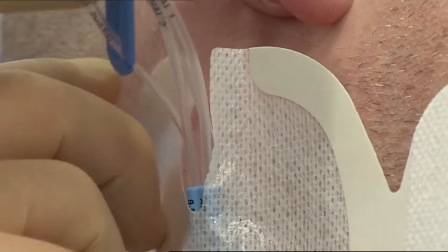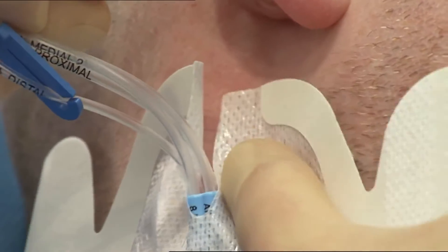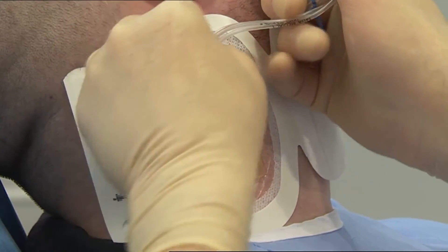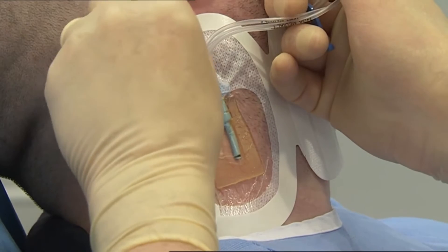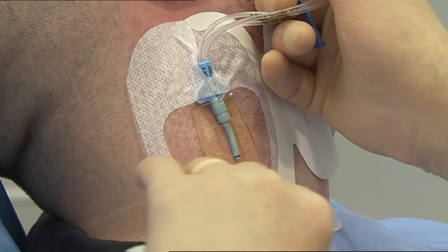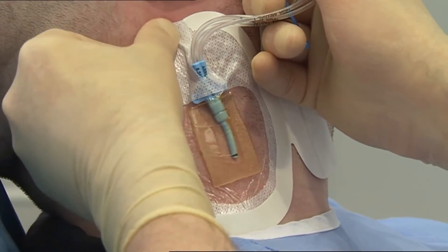Cross over the soft cloth section under the catheter lumen. Slowly remove the paper frame while continuing to smooth the dressing from the centre towards the edges using firm pressure to enhance adhesion.